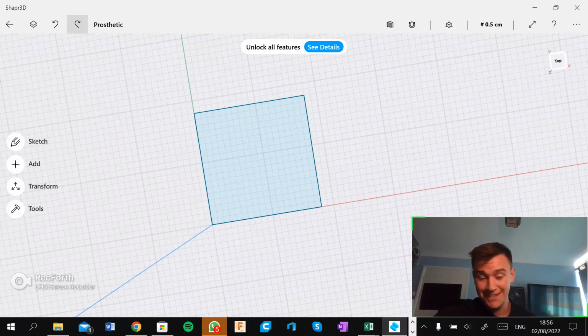There we go. Once again, using this software isn't the greatest by any means, so it took a lot of trial and error. So as I'm going through the redos that I've already done, it's going to be a bit painful to watch because nothing was properly tidied up, but it's the most genuine way of showing how I got to where I did with the design. So I thought I'd still include it, and if there are any really boring bits, I'll just skip through them. And if there are cutscenes, that's just due to the fact that I need to skip through some bits that are just painful to watch. So yeah, here we go.